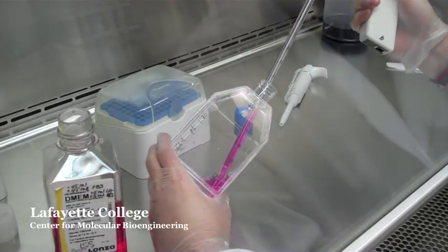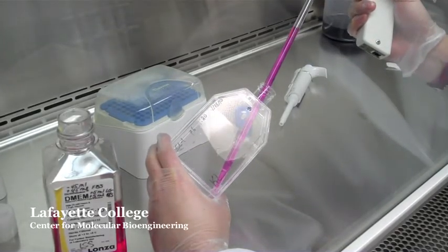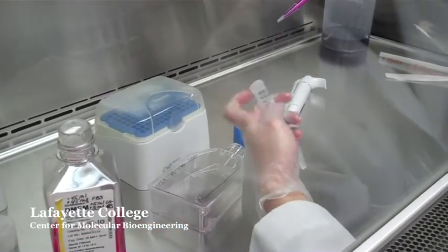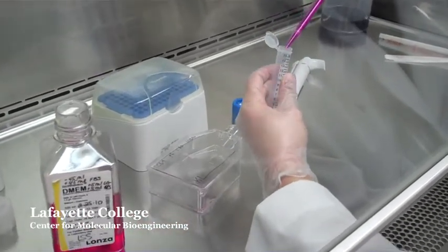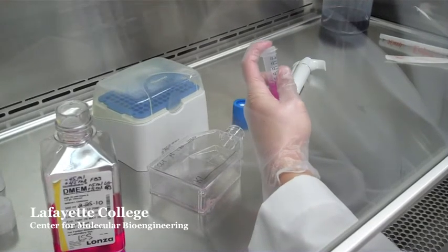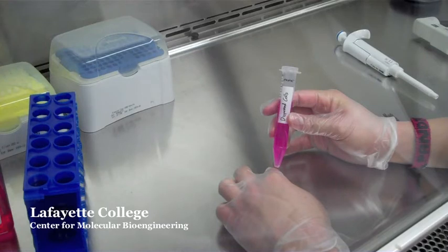Aspirate all 10 milliliters of the media containing the dispersed cells and place it in a 15 milliliter conical tube. From this point, you can passage these cells into another flask, count the cells using a hemocytometer, seed an experiment, or cryogenically freeze them down for later use.